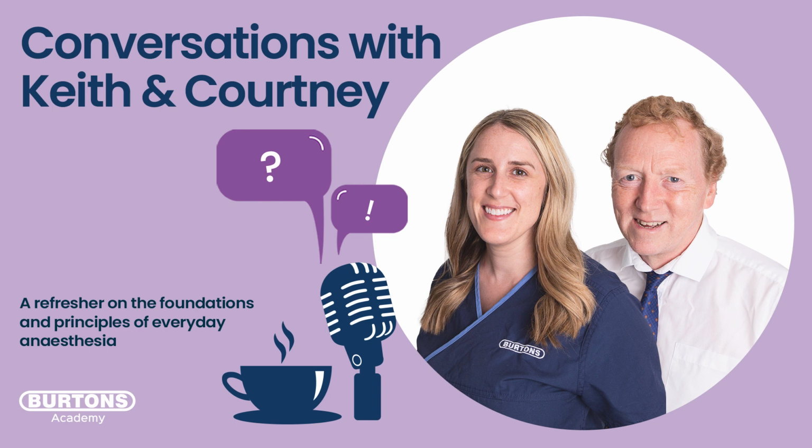So thankfully, I've not had too much of a problem taking over some patients, but I remember especially when I had a patient anaesthetized for imaging and having to keep their thorax still during CT, and these are normal, spontaneously breathing patients, and absolutely having to exploit their normal tidal volume size, stretching them and making their respiratory rate go really quick, just so that we brought that CO2 down so that they'd stop breathing for the 20-second scan where they couldn't move at all.